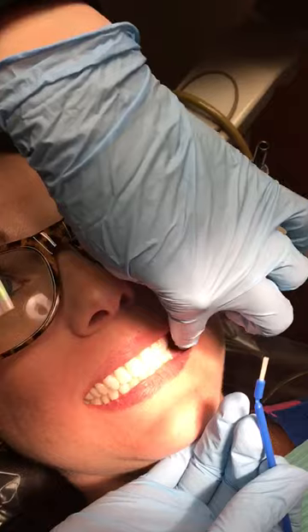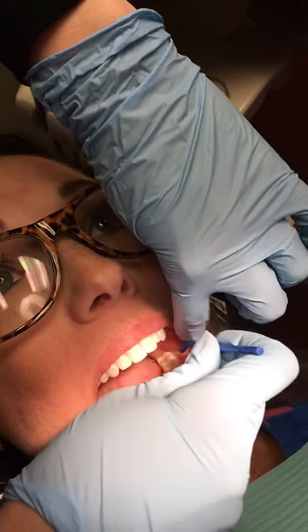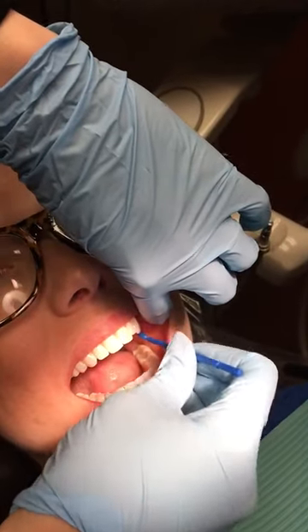Have them open again and do the same thing on the other side. Dip it again and swipe across the occlusals and facials, then do the same for the uppers.